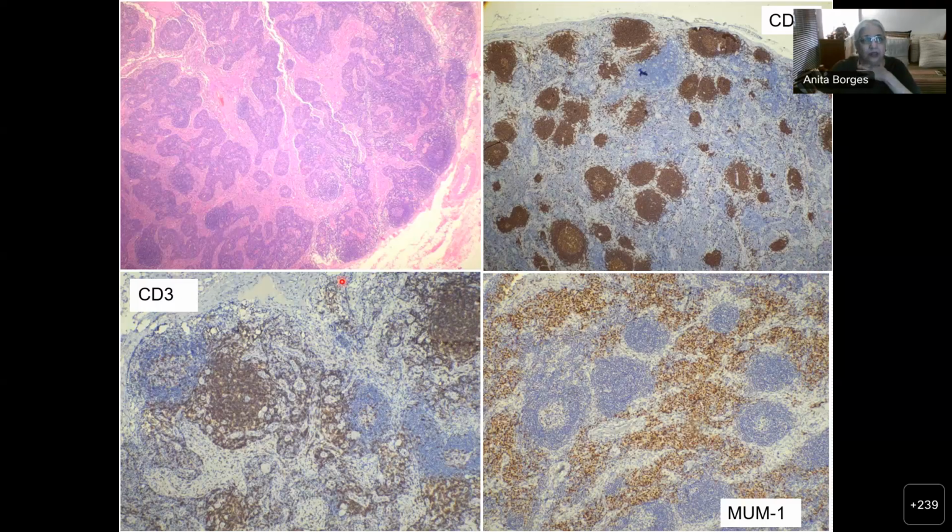You see that apart from the pink things, which are the sinuses, the rest of it is the medulla. And look at the medulla of this lymph node. It's just stuffed with plasma cells, which is where the plasma cells should be. So that's MUM1. Good.